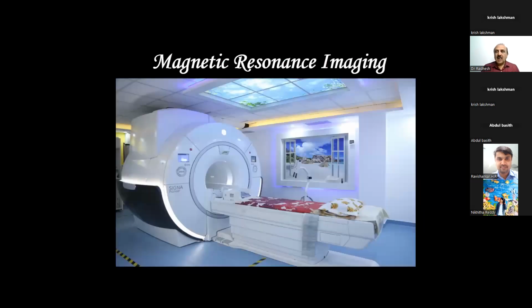So let's start off again with the photograph of MR. As I told you last time, this is the gantry of the MR. You see this hole here, that is where the patient is moved in. And a small recap for 3-4 minutes for those who were not there in the last class.